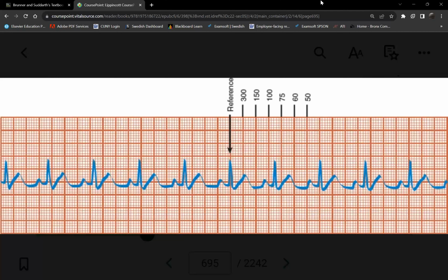If I move this two waves here, it would be 4. So it'll be what? 3.3, 3.5, and a half. Okay, so let's say 3 and a half. Remember, it's only an estimate. How many big boxes are there in 1 minute? 1,500. No, that's small boxes.